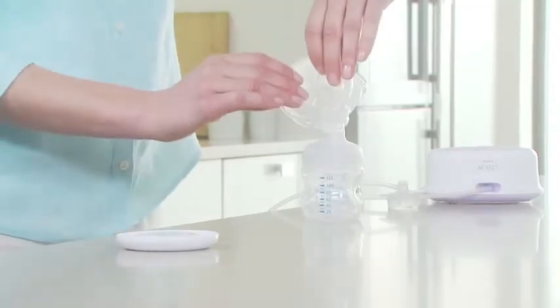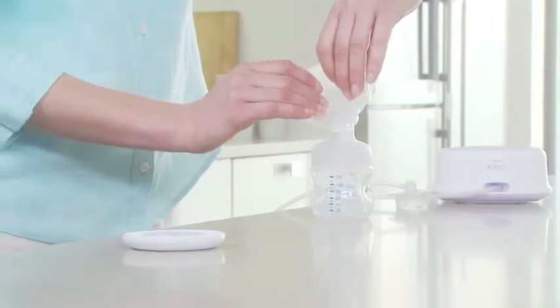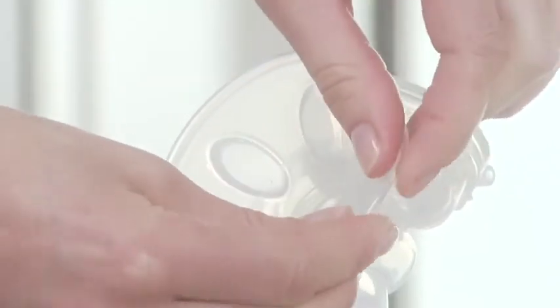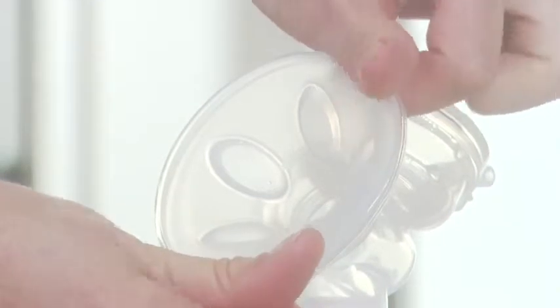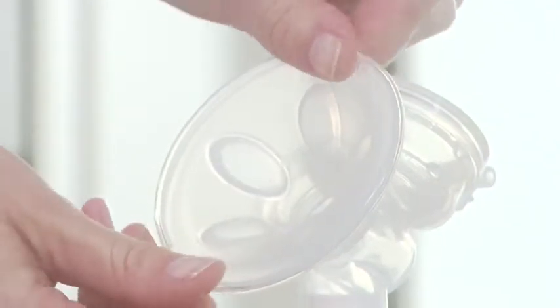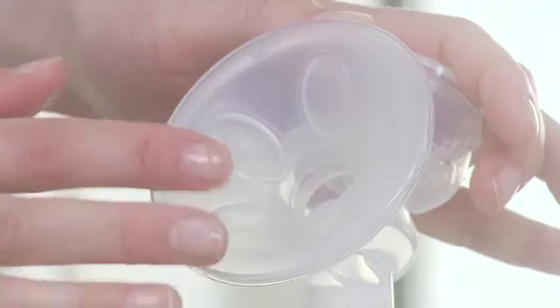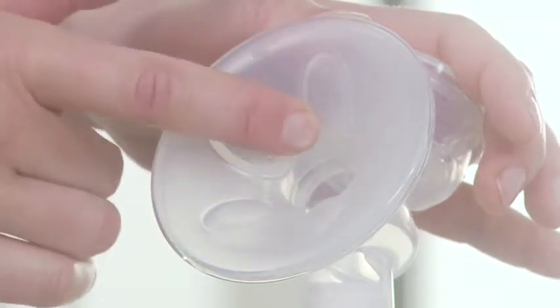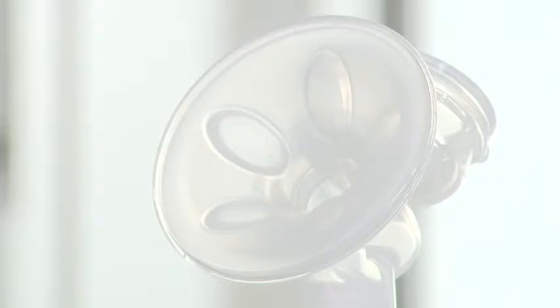Place the soft massage cushion into the funnel-shaped section of the pump body. Push in the inner part of the massage cushion as far as possible and make sure that it's perfectly sealed all around the rim of the pump body. Then run your finger on the flat surfaces between the petals to make sure there is no trapped air behind the cushion.